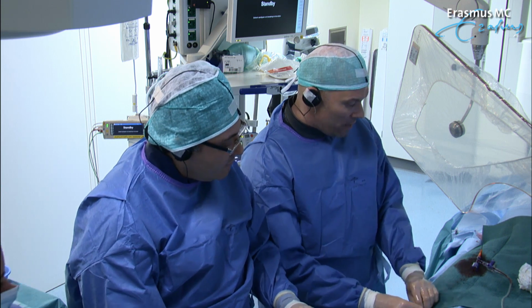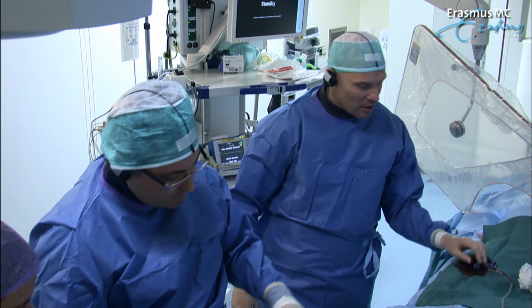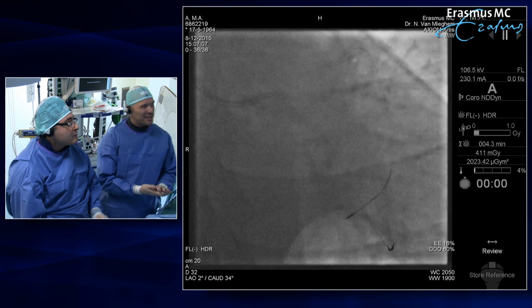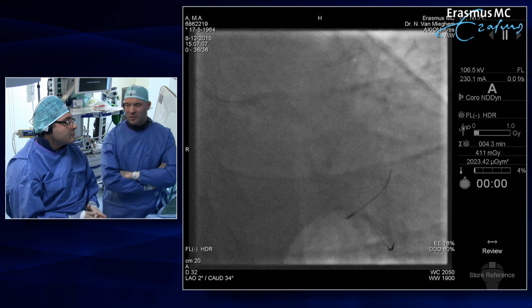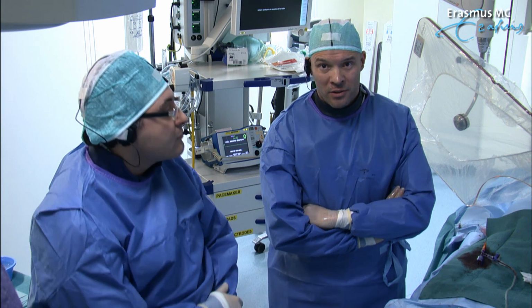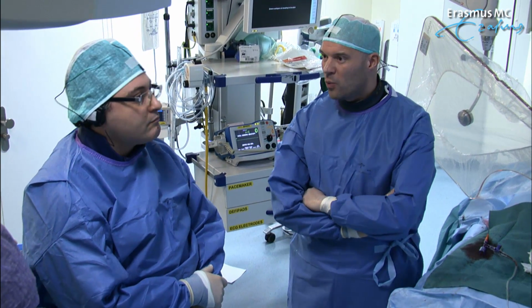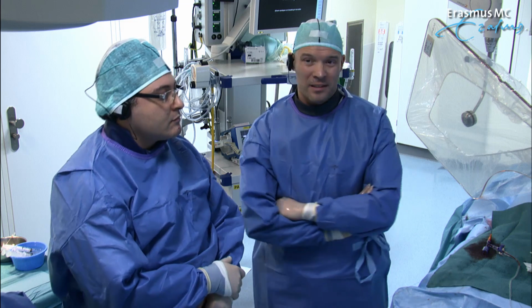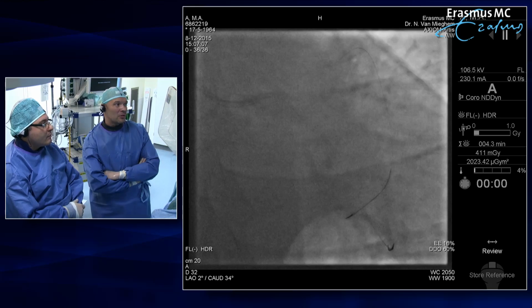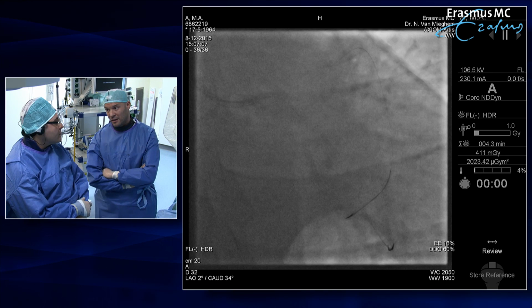So now we have to talk strategy here. We have a significant distal, relatively complex left main stem disease. And I think we have to start talking about our stent approach. I think we all know that provisional stenting is the strategy of first choice, but in this particular case we have a Medina 111, so there is disease in the distal left main, in the proximal LAD, and in the proximal circumflex. So I would be in favor of doing a two-stent technique.